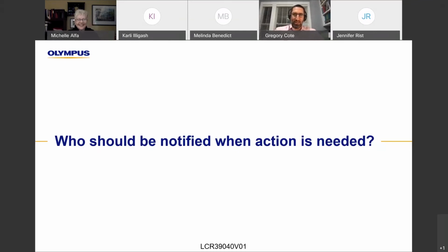That's coming next. Well, when you're embarking upon a program like this, your infection control group should be a part of it in some capacity. They should at least be aware of the fact that you are doing it. And so they immediately need to be notified, number one, to help interpret the significance of the finding, although your endoscopy nurse managers and endoscopy directors need to know that this is a significant result as well. You should not rely on your microbiologist to tell you.